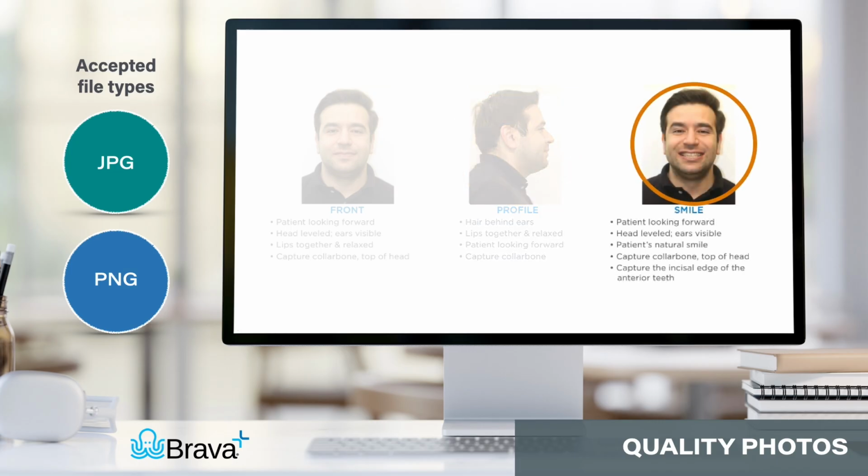For the smile, make sure the patient is looking forward with their head leveled and ears visible. The patient's smile should be natural. Capture the photos from the collarbone to the top of the head. It's important to capture from the incisal edge of the anterior teeth.